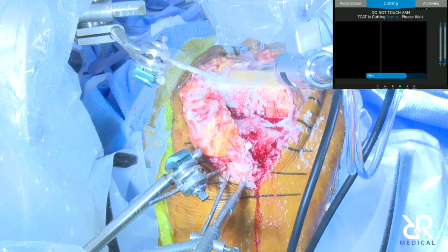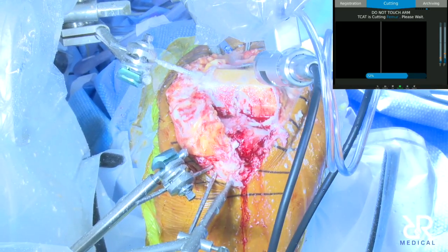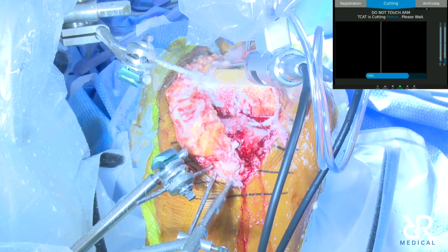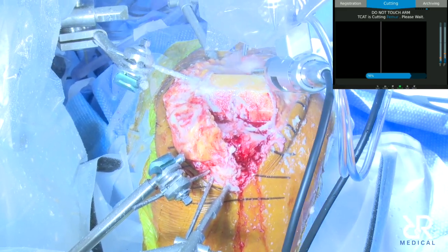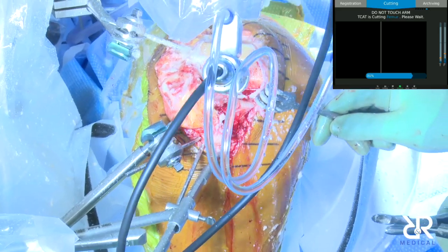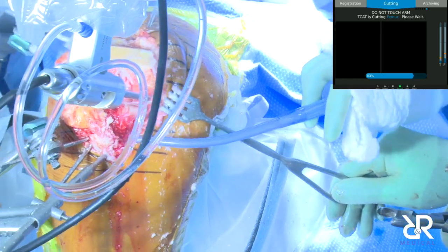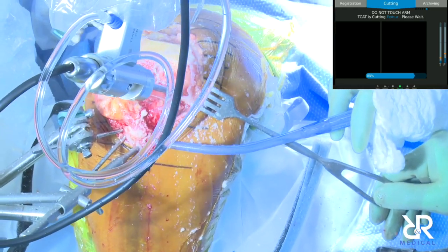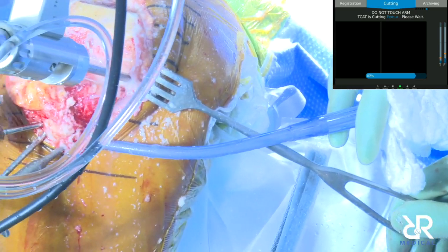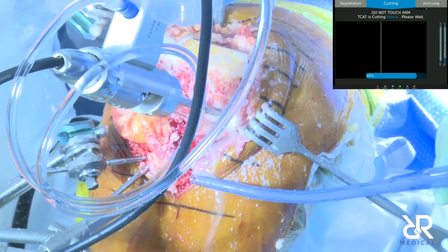I use posterior condylar kinematic alignment, so I take 9 and 9. The implant is 9 millimeters, and every once in a while I'll do 9 and 8. But I'm a firm believer in kinematic alignment. So with this technology, you can do what I call responsible kinematic alignment, right? Because I try not to go outside of 3 degrees of varus on the tibia, which I think is safe. And again, with this, you can do it.